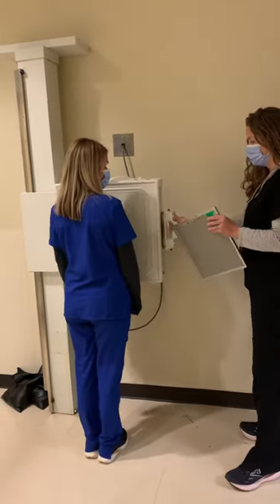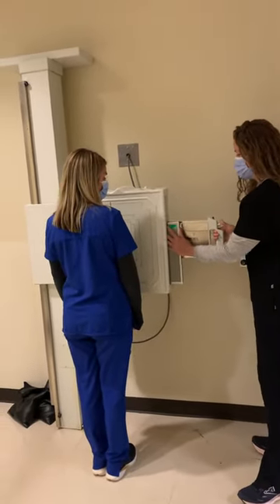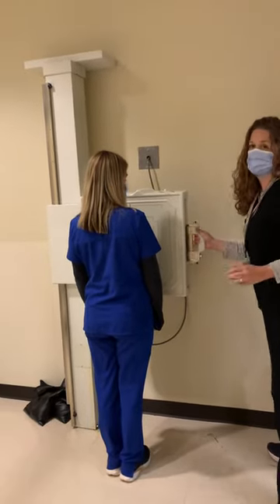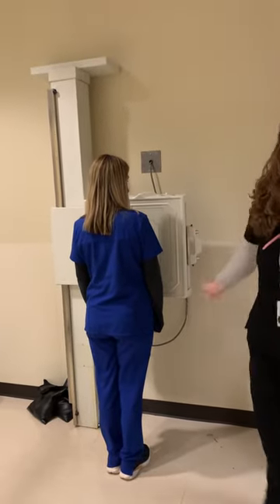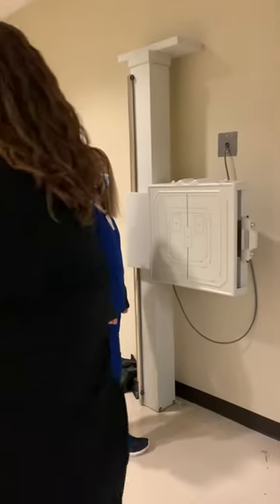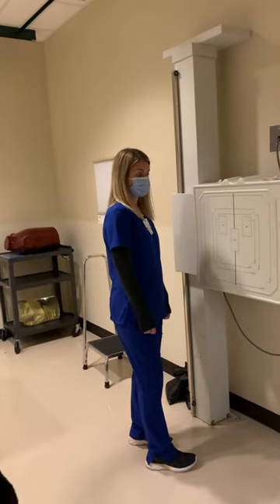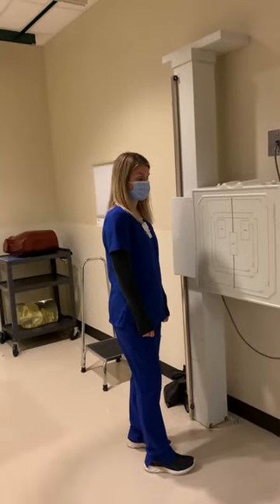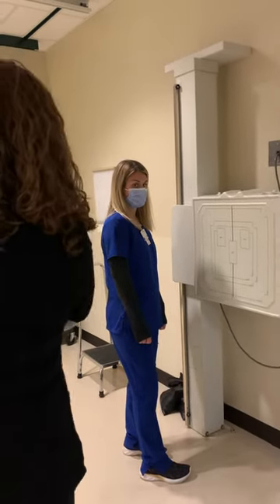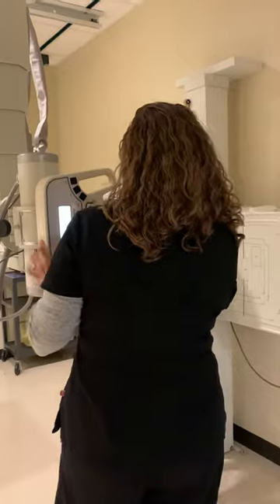Today we're going to demonstrate the parietal Waters view for facial and nasal bones. We have a 10 by 12 lengthwise in the bucky, and we are going to move to 40 inches for our SID.